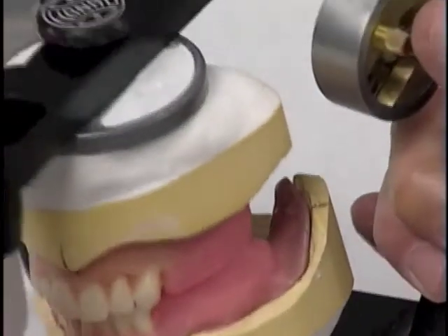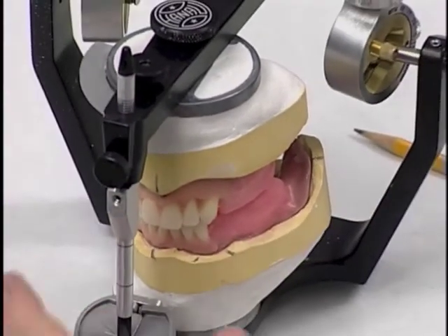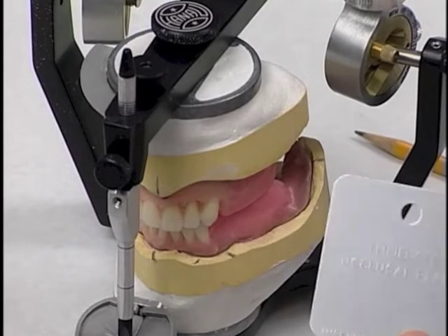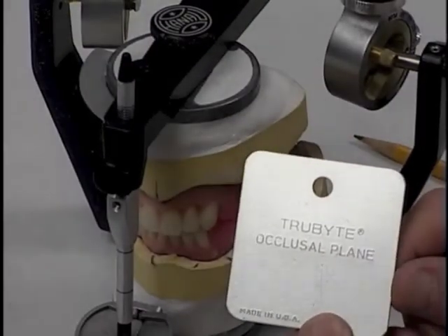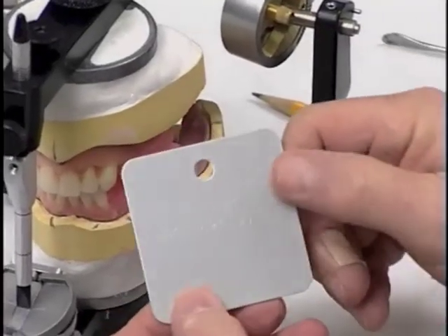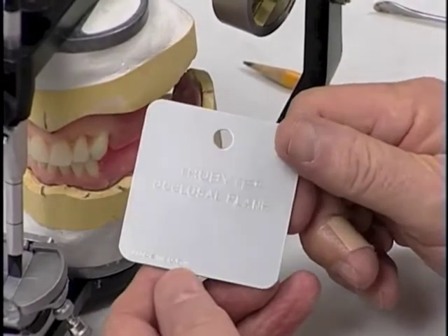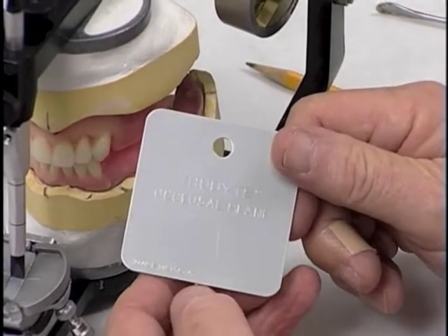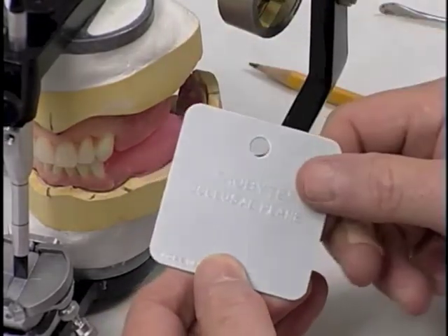So with that, we can start arranging the posterior teeth. In order to keep the teeth perfectly flat, we're going to use a TrueBite occlusal plane guide, which is just a very flat piece of metal. It is perfectly flat so that if we lay this on the occlusal surfaces after they were arranged, every cusp of every posterior tooth should touch this flat plane.